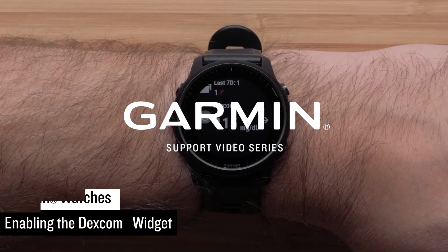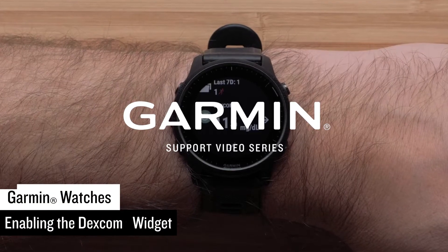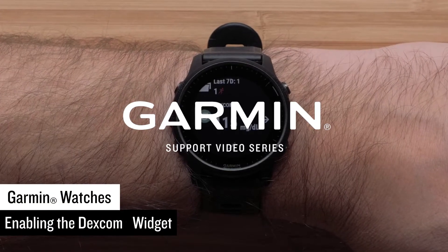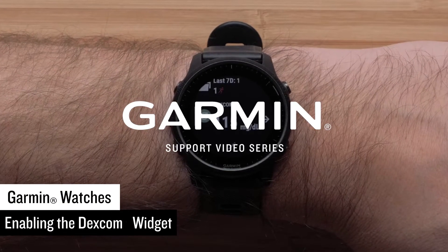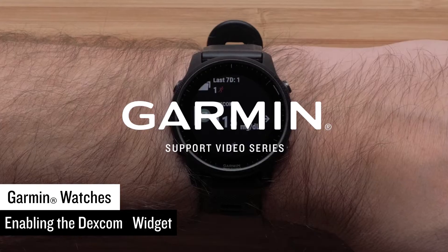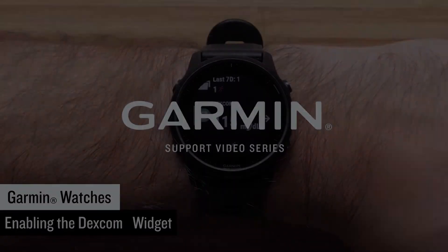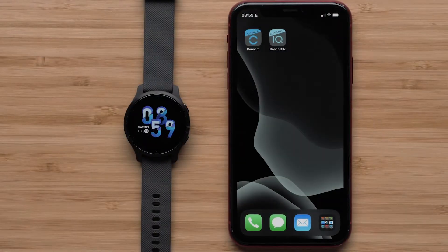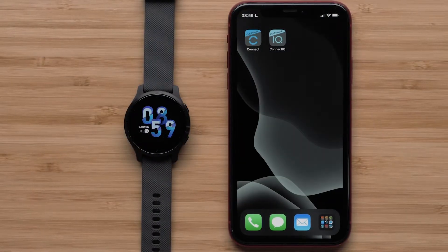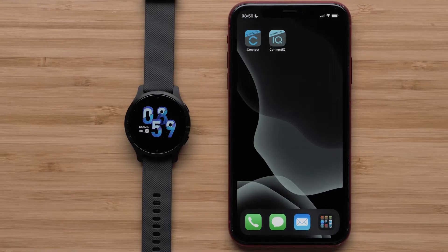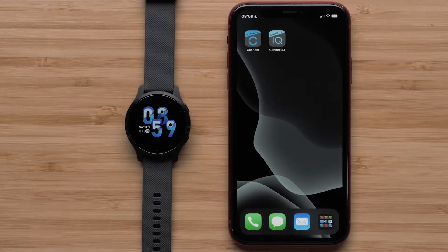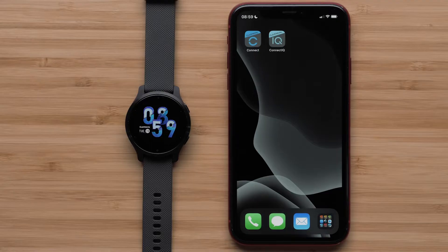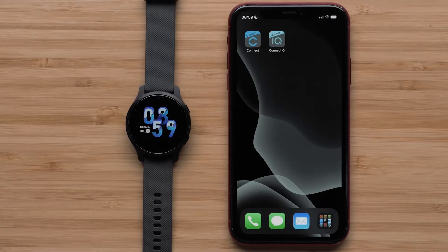In this video, we will show you how to download and enable the Dexcom widget on your compatible Garmin watch. To enable the Dexcom widget to see your glucose levels recorded by your Dexcom continuous glucose monitoring system, you will need your watch and compatible smartphone.